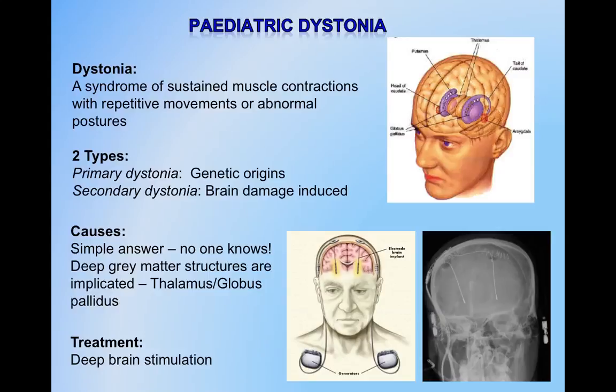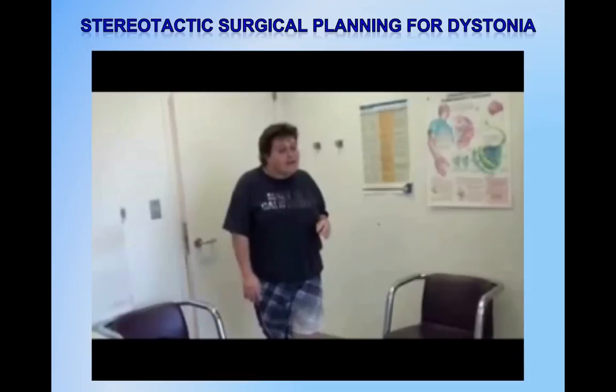We effectively stick electrodes in and then you have a pack here. It's a bit like a pacemaker that fires current through the electrodes, and they're continuously firing, and when they do so, it helps to abate the symptoms. And here's an X-ray of a patient that's actually got these electrodes in. Okay, so here's a movie that I grabbed off of YouTube.